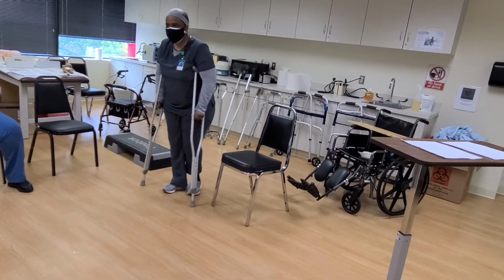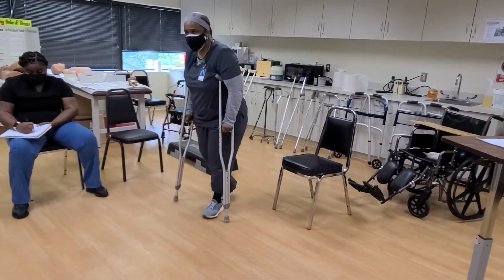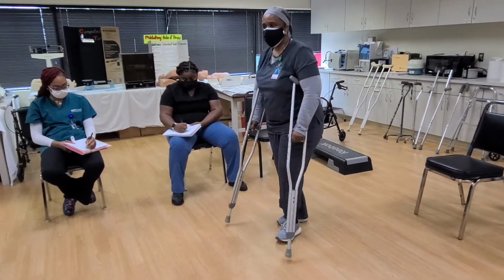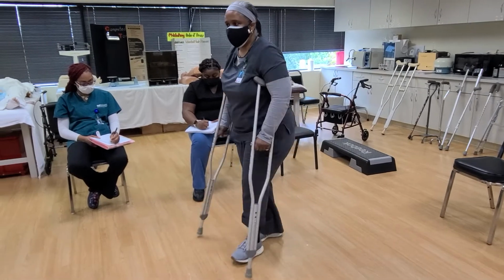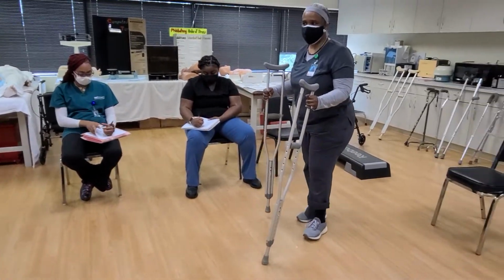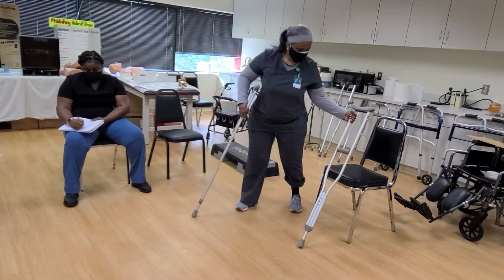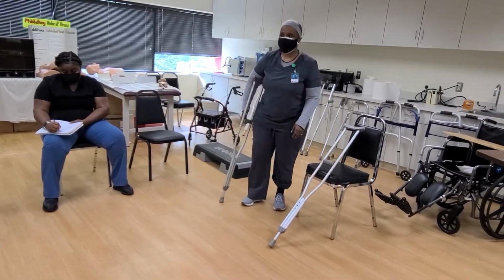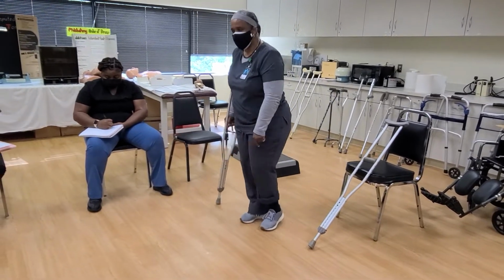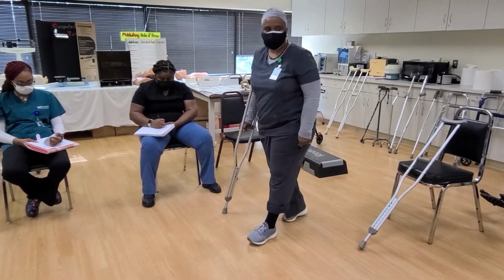Or you could have somebody do this. They can walk, this would be partial weight bearing, or a little bit more weight bearing if tolerated, okay? Now what if I had one crutch? I would put it on the non-affected side, right? So that I can walk with the crutch and the affected side together, okay?